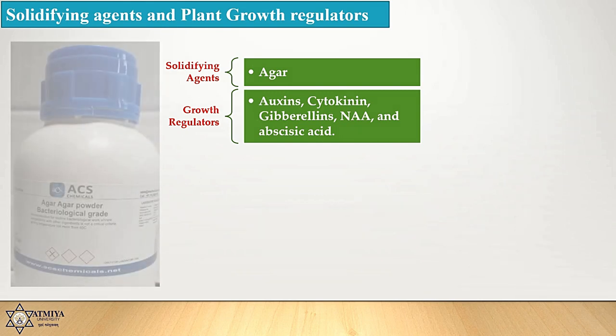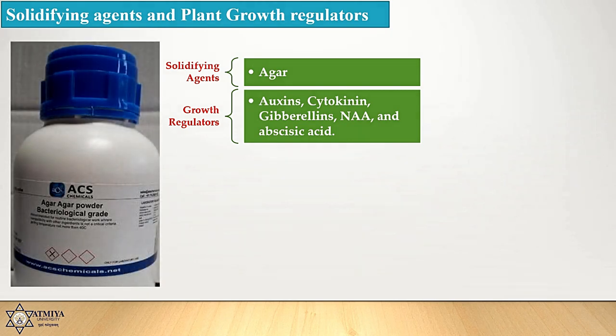First, when agar is mixed with water, it forms a gel that melts at approximately 60 to 100 degrees Celsius and solidifies at approximately 45 degrees Celsius. Thus, agar gels are stable at all feasible incubation temperatures. Additionally, agar gels do not react with media constituents and are not digested by plant enzymes. The agar concentration commonly used in plant cell culture media ranges between 0.5 to 1.0%.